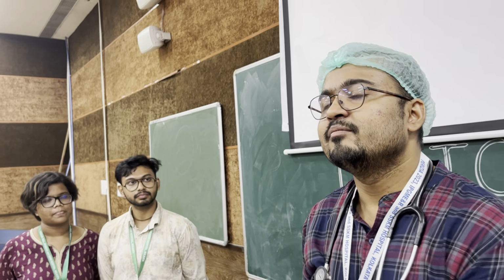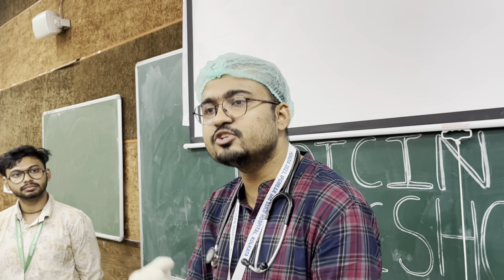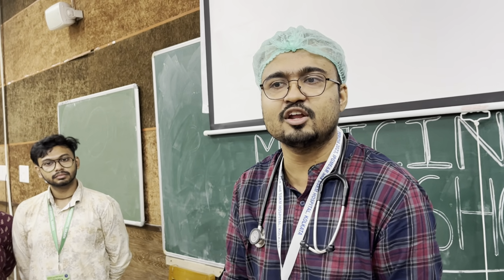So by X-ray, by aspirating the contents, by hissing sound, and by gush of air, gargling sound, you can confirm the ideal position of the Ryles tube.